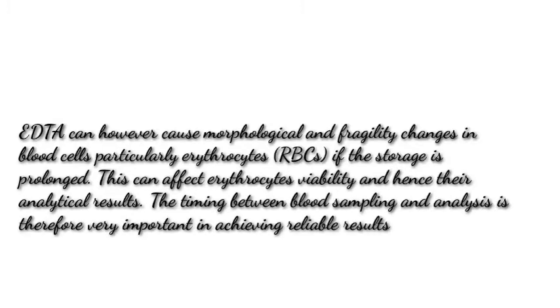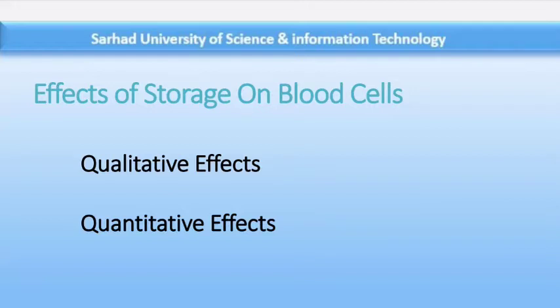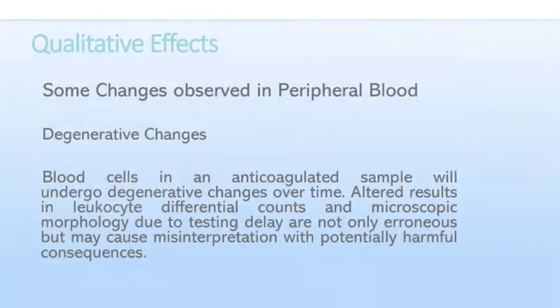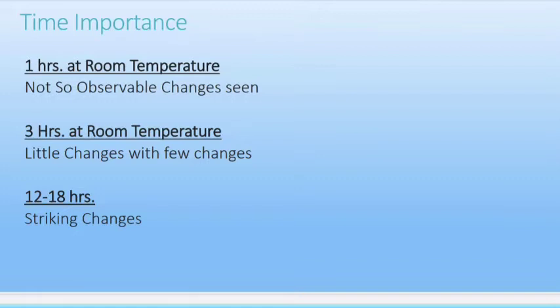If a blood film is allowed to stand in the laboratory before peripheral smears are made, some degenerative changes occur. These changes are not due to the presence of an anticoagulant, as they also occur in defibrinated blood. Films made from blood standing for no more than one hour at room temperature are not easily distinguished from films made immediately after blood collection. By three hours, changes may be observed, and after 12 to 18 hours they become striking.